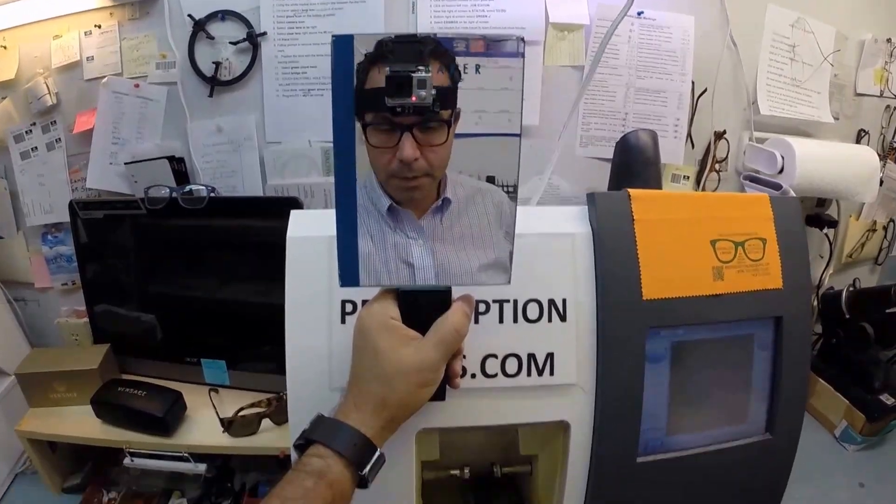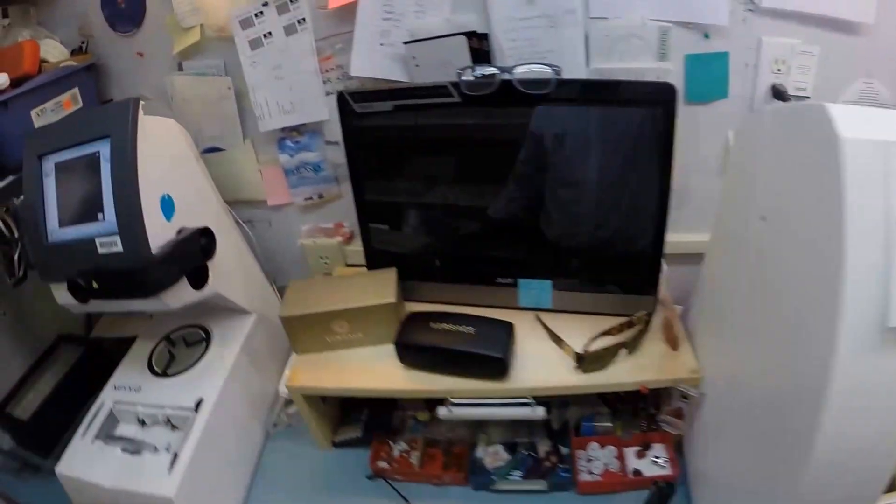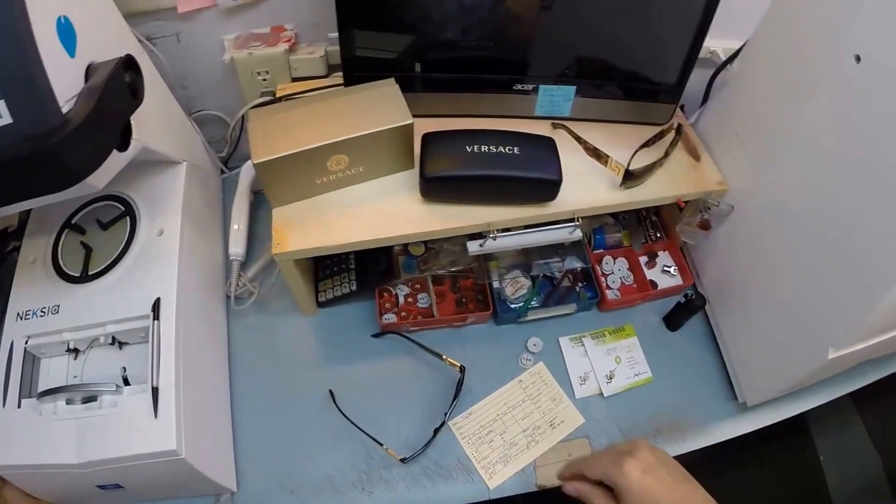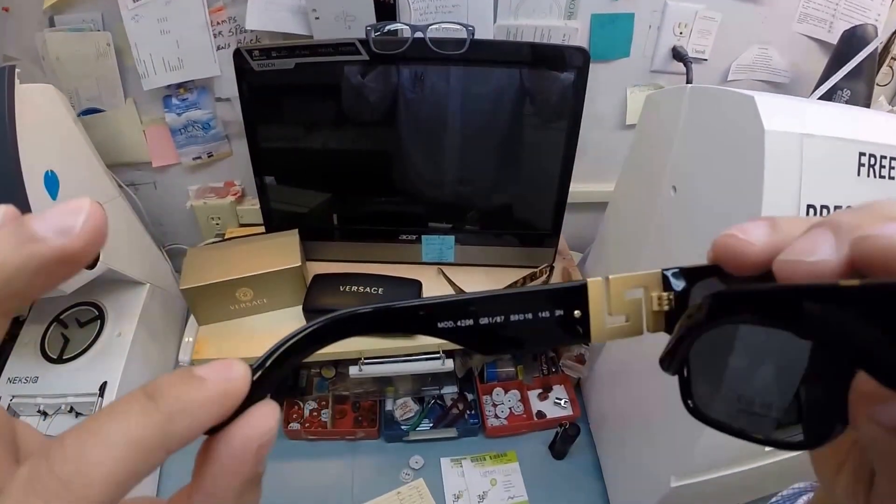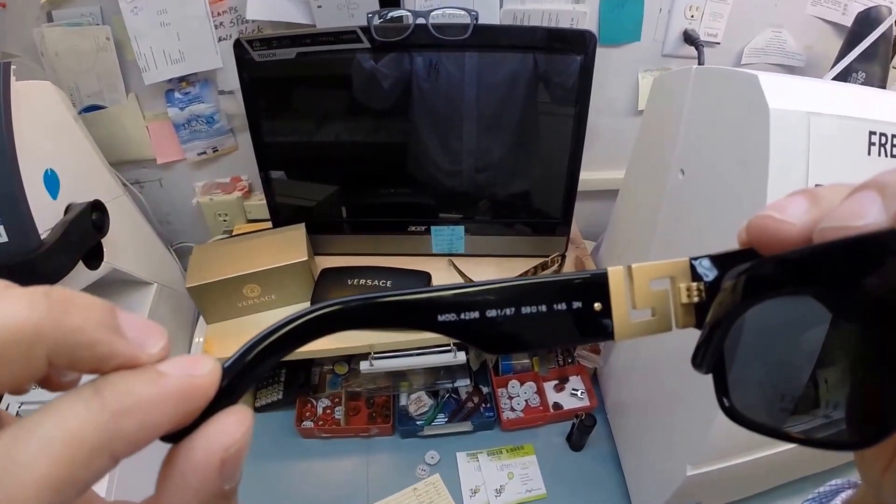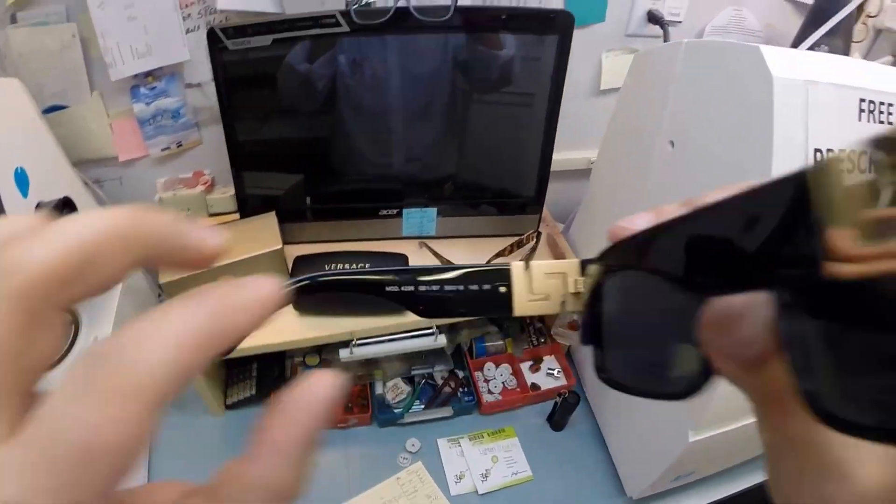Hey Tyler in the Bronx, Matthew here with FreePrescriptionLenses.com. With the help of my GoPro camera, I'm going to show you how I cut prescription lenses for your new Versace 4296, color GB1, which is the classic shiny black in the 59 eye size.